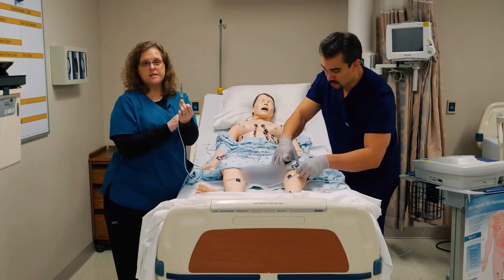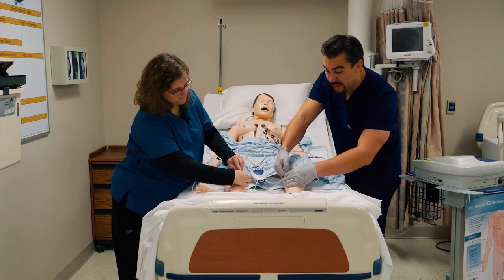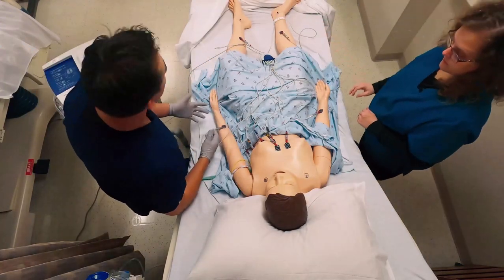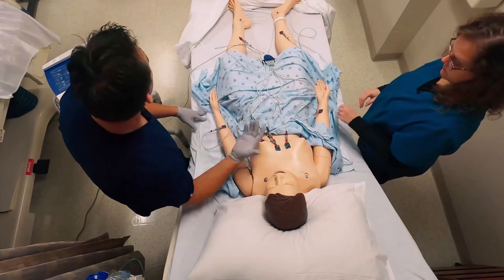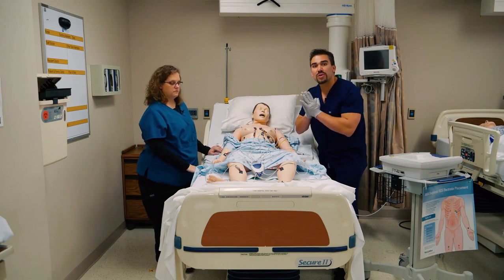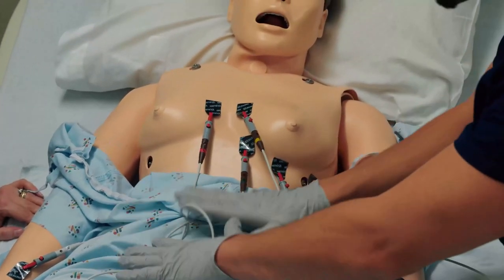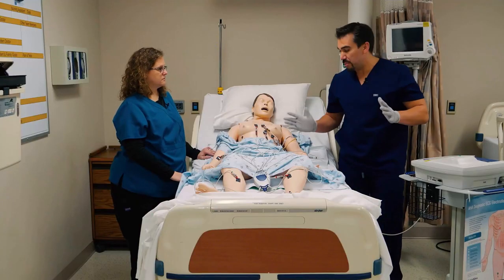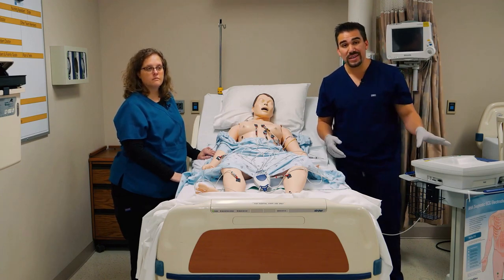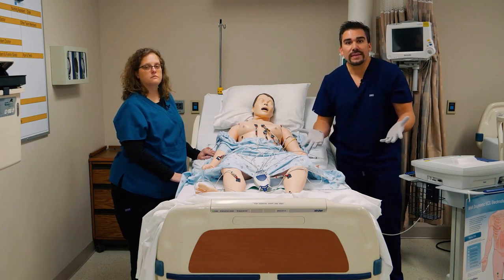Trust me — when the doctor's urgent and the patient is coming in with severe chest pain, you're in a rush. The patient may be diaphoretic and sweating, stickers are sliding, and you're trying to hook things up. It is crucially important that you place them in the right spot and keep everything as flat as possible. When the patient is in pain and moving, it throws a lot of artifact on the EKG, and the doctor will have you redo it because artifact prevents you from seeing ST elevations or anything else you're trying to identify.